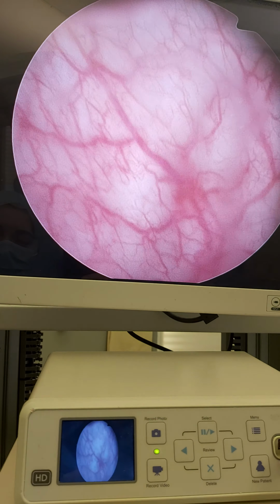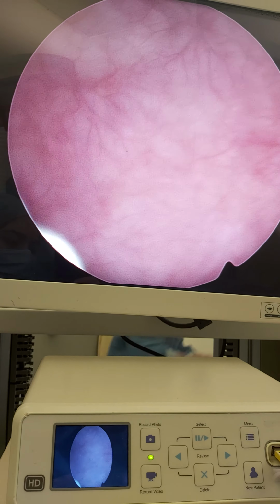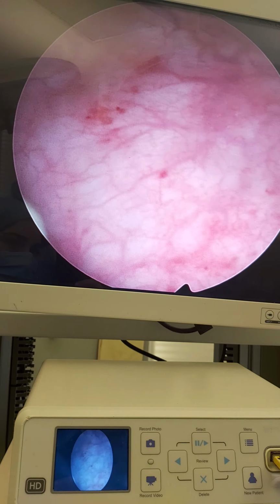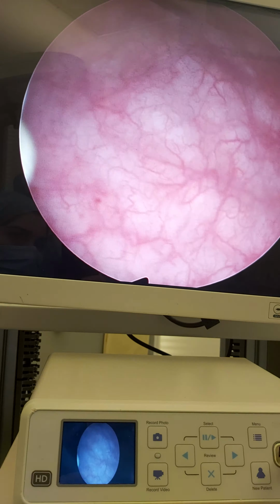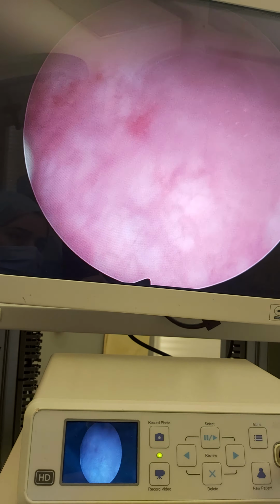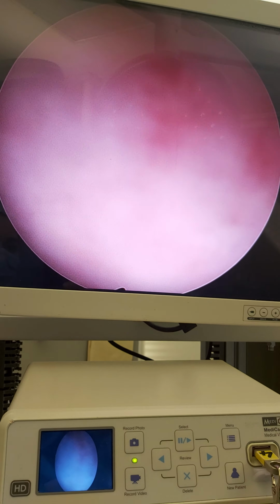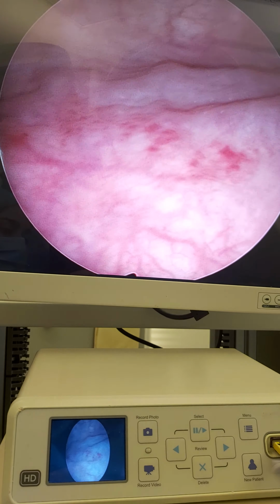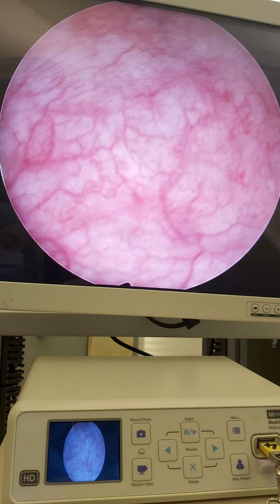Let's look at the rest of the bladder. She had significant infections after the procedure. I will fulgurate these parts too. There are some patients who do not respond to treatment, and I always think they have long-term diseases affecting their bladder, and actually she was not one of them at the beginning. She had a good response. Then she began to have significant infections in not sensitive cultures, in normal cultures.